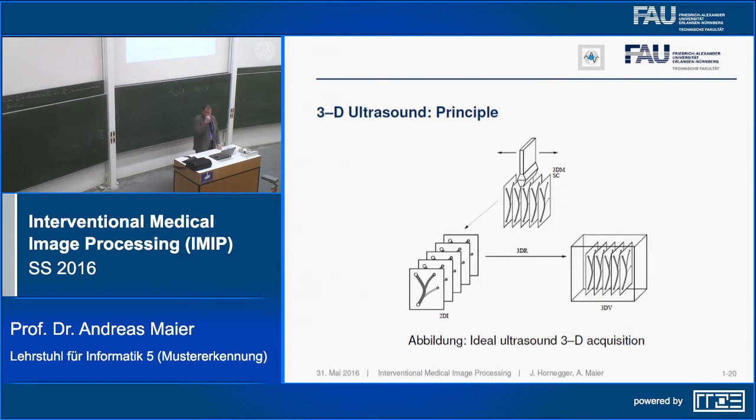Very well. So the idea for 3D ultrasound is very similar to what we did in 2D ultrasound, and now we just want to have many slices and want to rearrange them through a volume. So for example, you could have a transducer and then move it at a fixed speed, have a fixed frame rate, and then you get this kind of slice images, and you can realign them to a 3D volume. So this would be the ideal world, and you have some operator there, and he's able to constantly move at the same speed, and you get exactly your 3D volume. So no big deal.